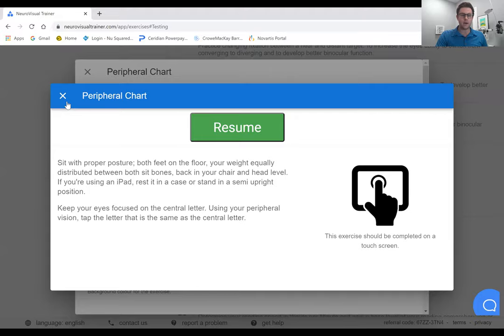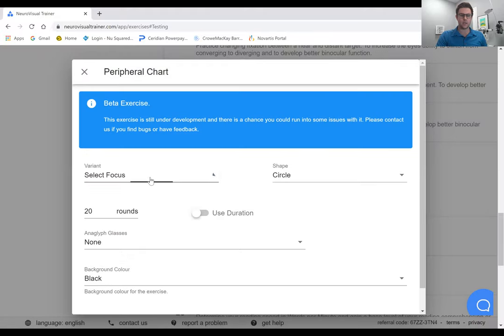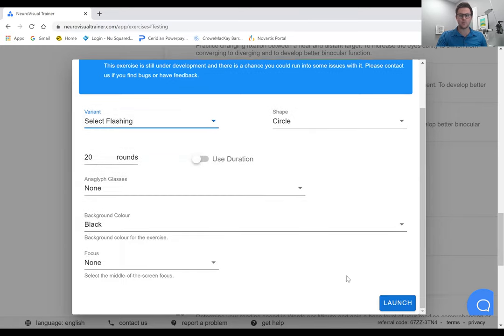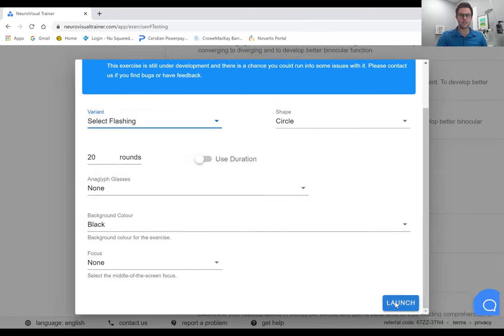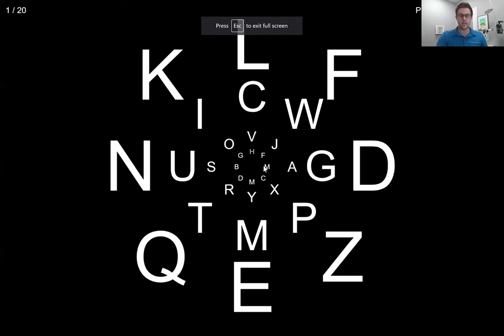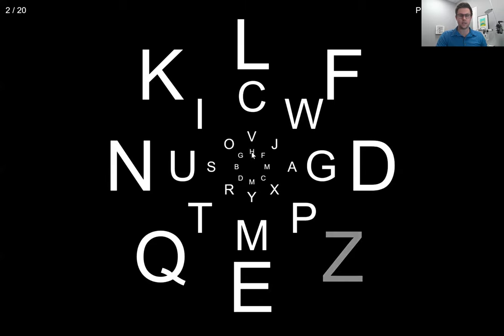What I really love is you can also use the select flashing feature. In this case you'll have patients looking at the center point and you're going to get them to click the letter that's flashing.